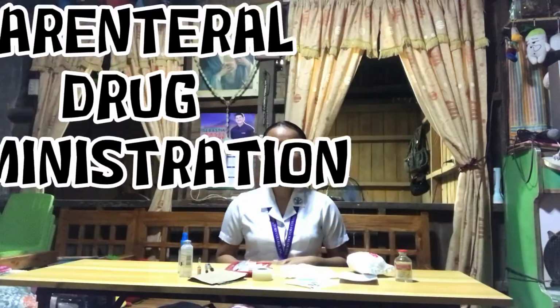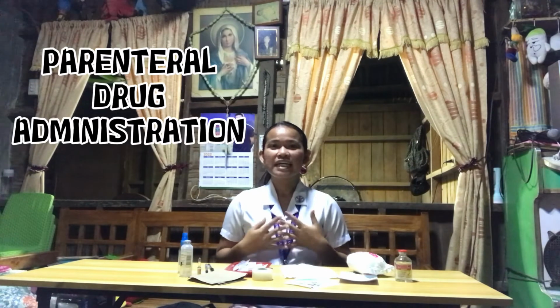Hello everyone, my name is Charmidale Blanco, a student nurse from BSN1 11D, and today I am going to demonstrate parenteral drug administration, including the intradermal, subcutaneous, and intramuscular injection.